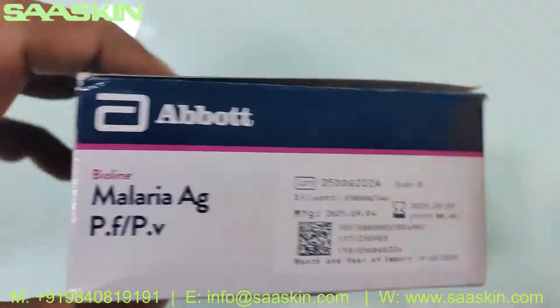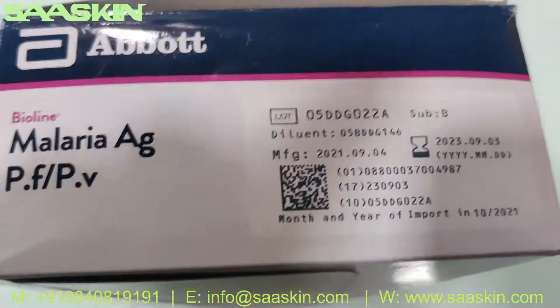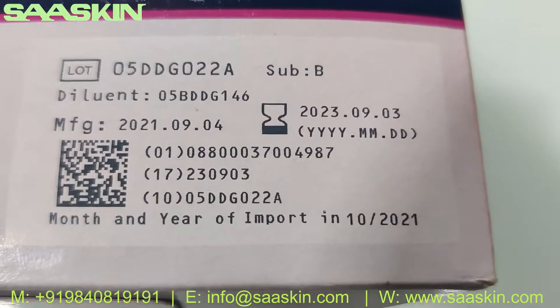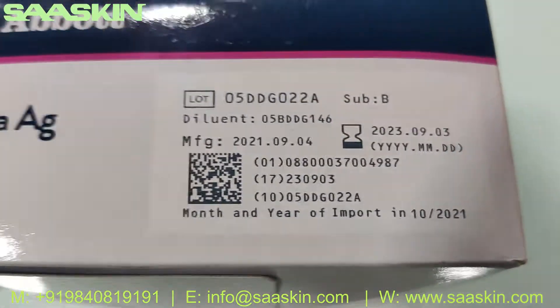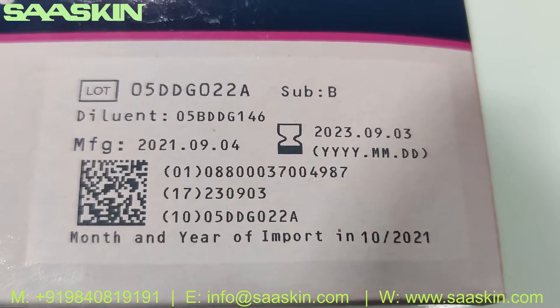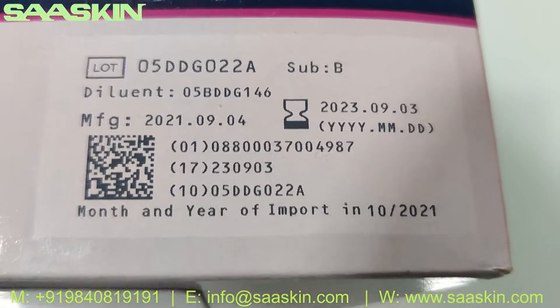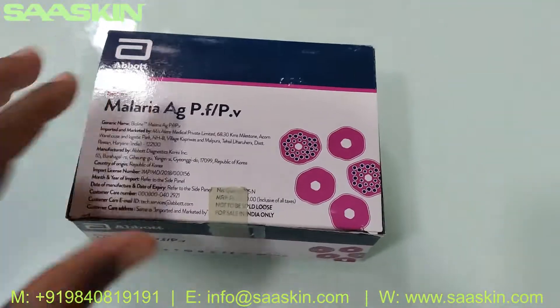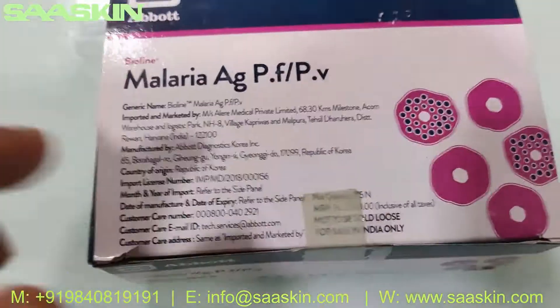On this side of the box you can see the expiry period — on a standard pack it's two years. You also get the diluent number, lot numbers, and this kit's lot number. Now let me open the box.